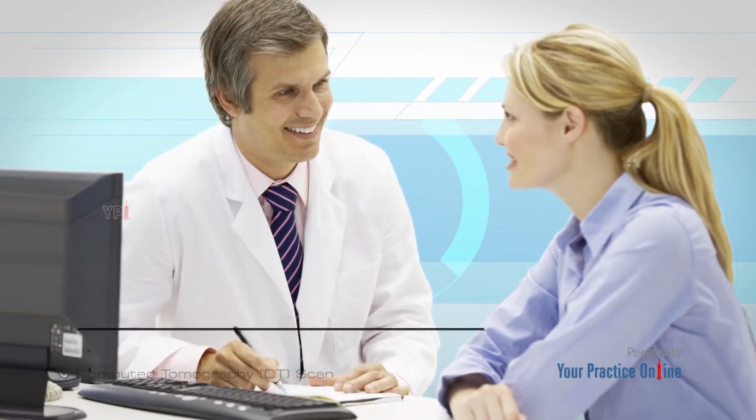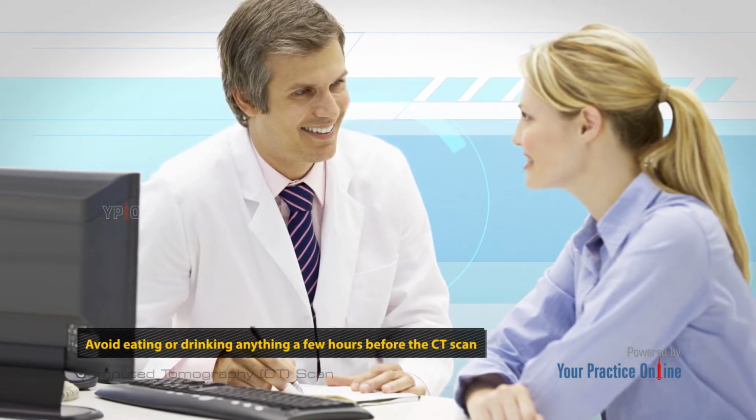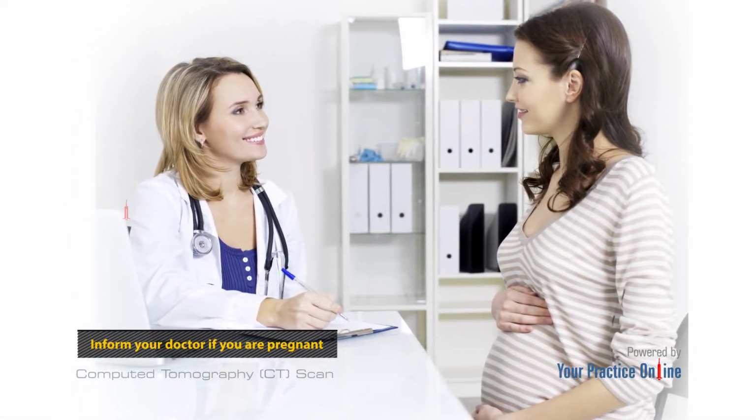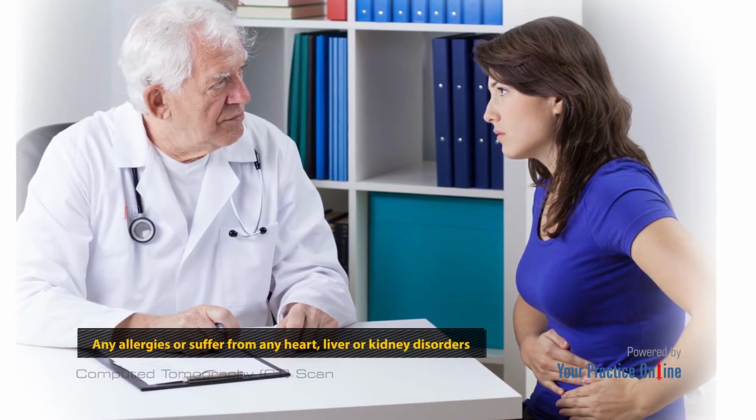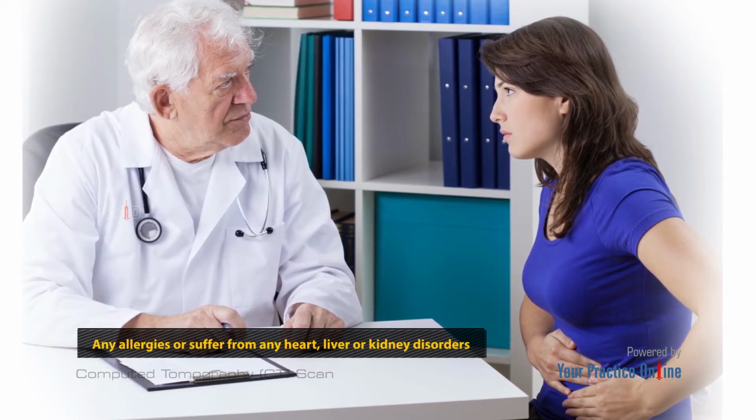You will be advised to avoid eating or drinking anything a few hours before the CT scan. Inform your doctor if you are pregnant or think you may be pregnant. You should also inform your doctor if you have any allergies or suffer from any heart, liver, or kidney disorders to avoid reactions to the contrast dye.